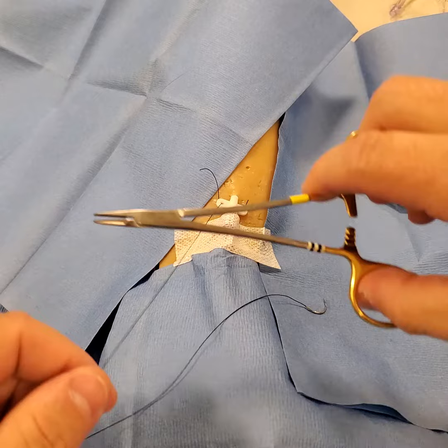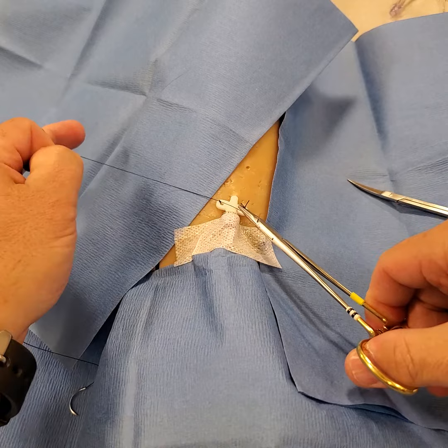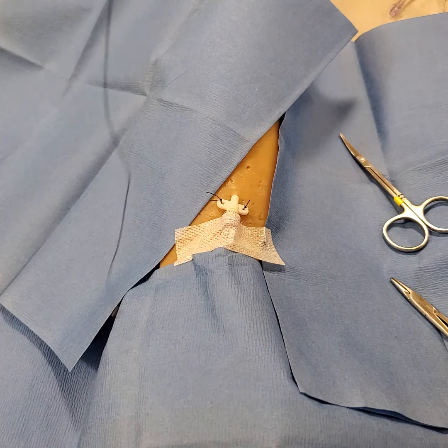Then tie one, two, three — pull taut. One, two — pull taut. One, two, three — pull taut. As long as there are three knots in a descending tying fashion. You can then discard your sharp.